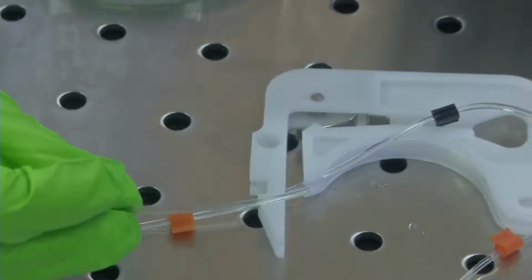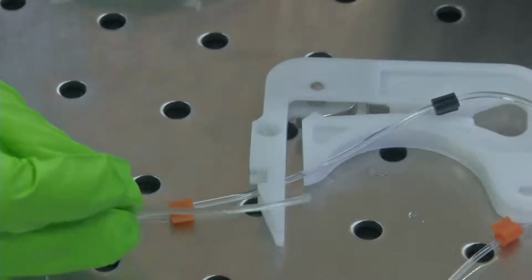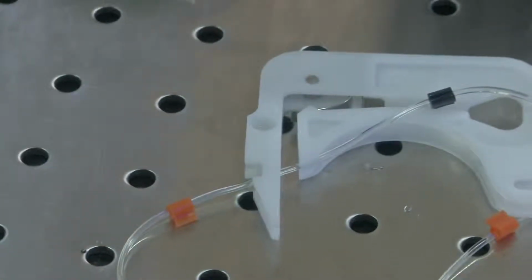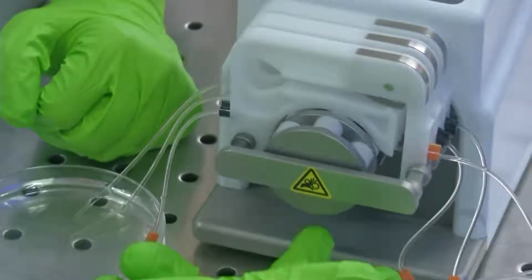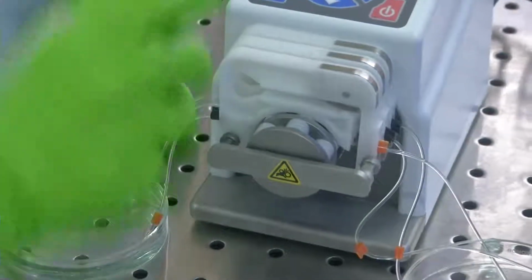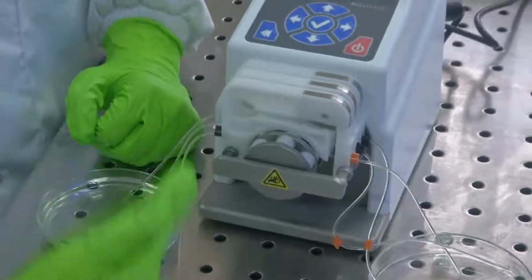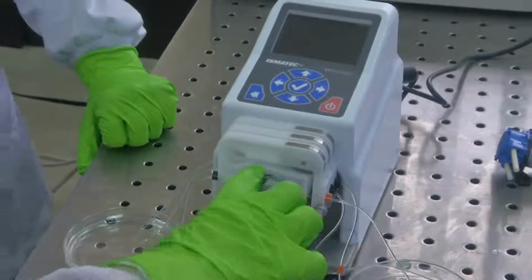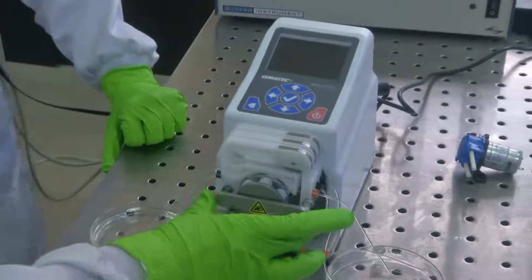This tube is tensioned between the tubing bed and the rotor. So this is the rotor, this is the tubing bed, and the rotor is what actually drives this.